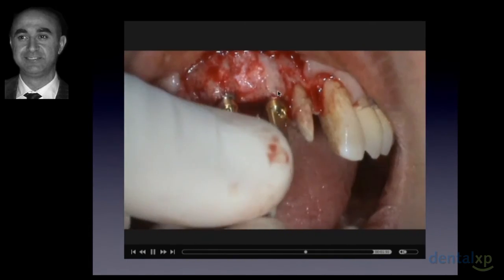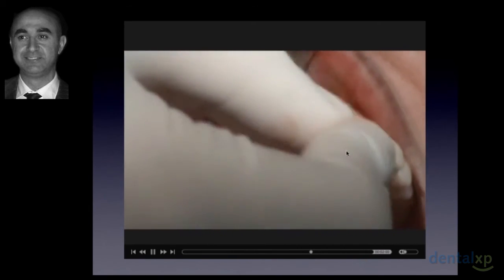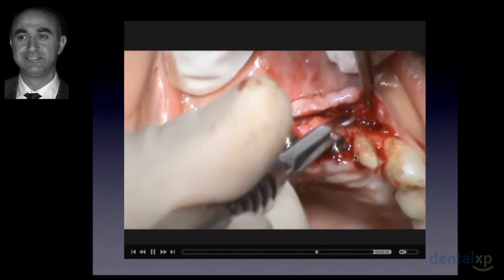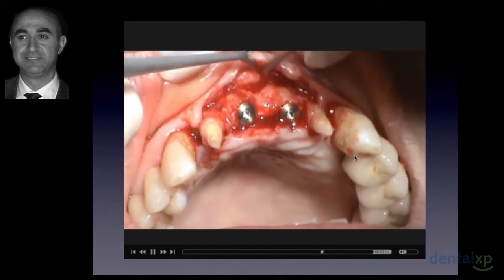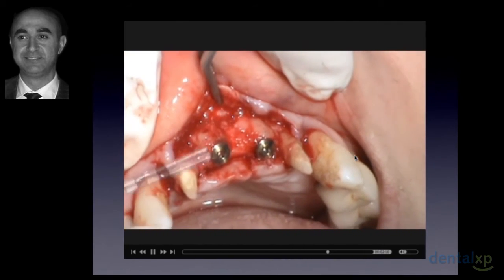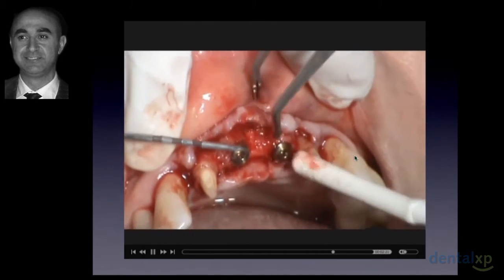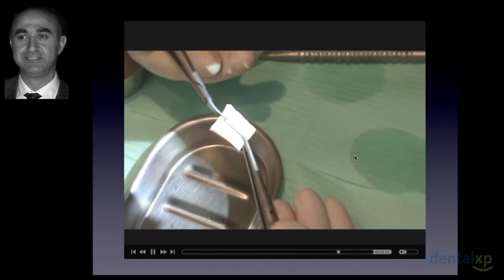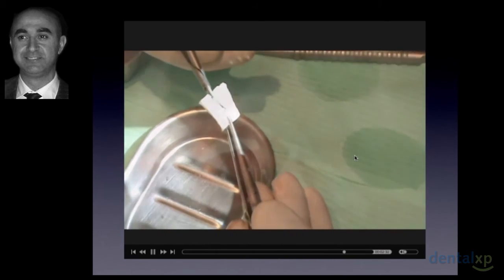And due to the difference in levels of the bone blocks in this area, since I'm using a Laser-Lok implant, which has been proven scientifically to have physical epithelial connective tissue attachment to these microchannels on the heads of the implants, I'm not really worried about recession in this area. Although, according to a Cochrane systematic study from Marco Esposito, it has been shown that there will be some kind of vertical resorption of these types of bone augmentation procedures.